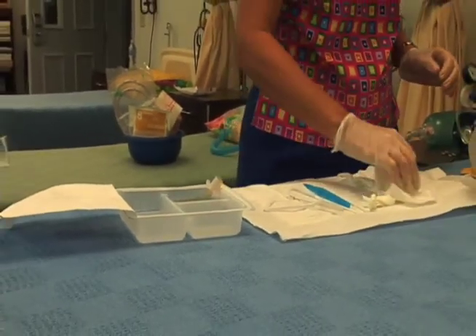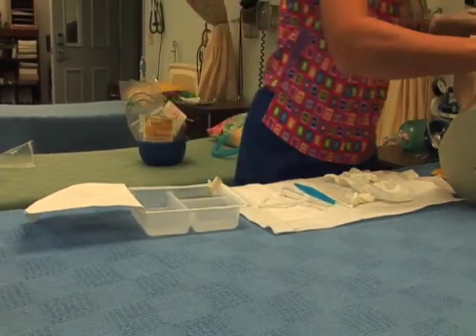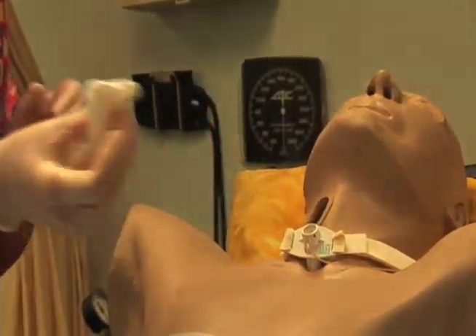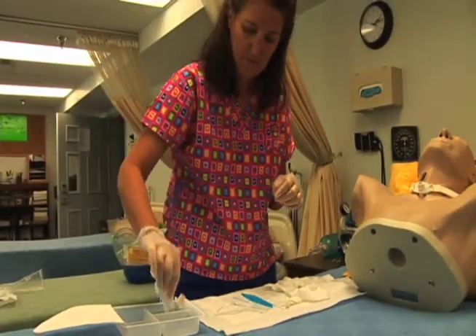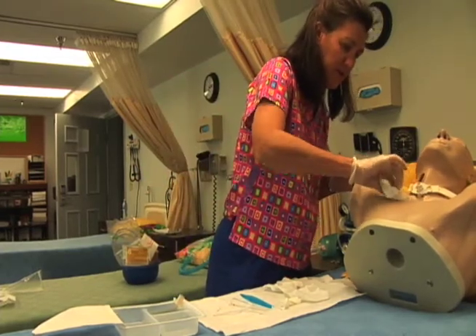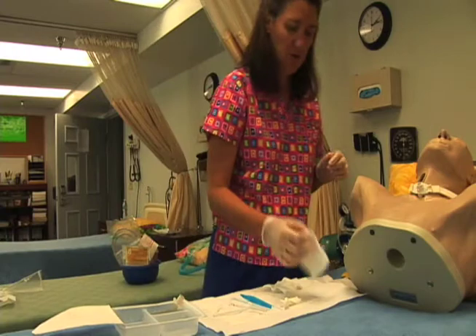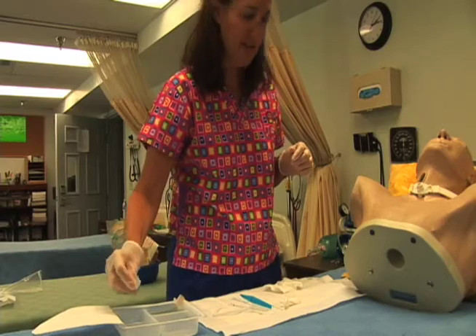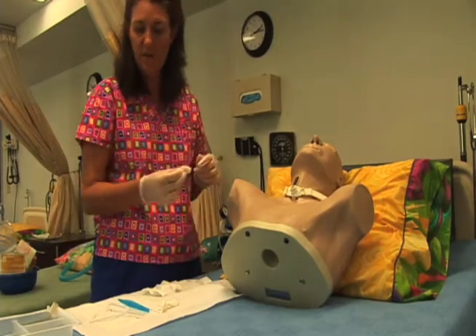While I'm cleaning the outside, if I need to use peroxide, I can just dip it in this other peroxide, and I work from inner to outer, so around the area to the outside. And then you can use the opposite side. Cleanse it from inner to outer. And then you would go around your sterile field and drop it in your trash can. You can use this a couple times, but always when you finish with water instead of peroxide. And you can do this on the top side too if you need to.